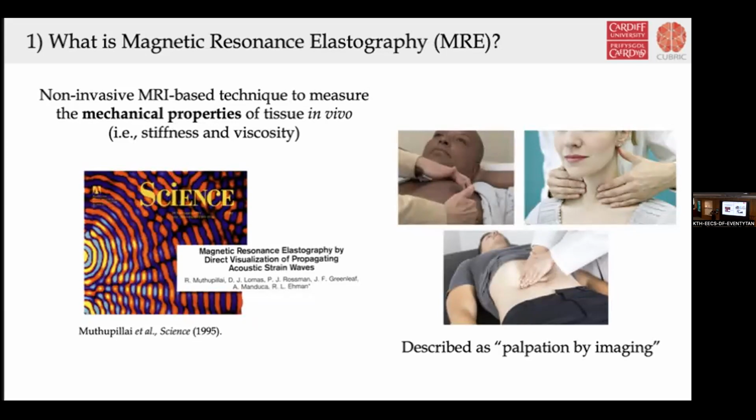And it's regarded as being a kind of remote palpation, as a physical property is being measured. And we know that manual palpation has been great at detecting diseases for centuries, because physicians move their fingers across the tissue and they can feel the shear deformation, which identifies nodules, lumps, or tumors.